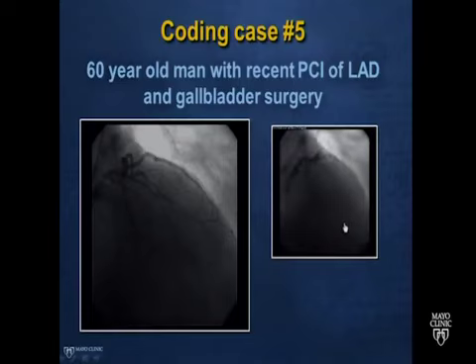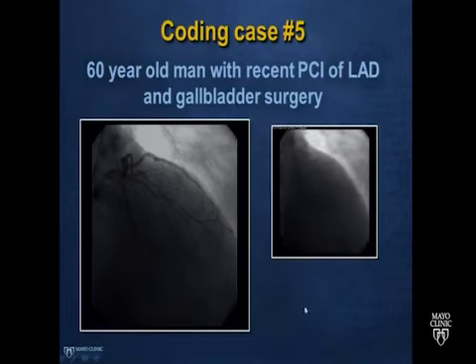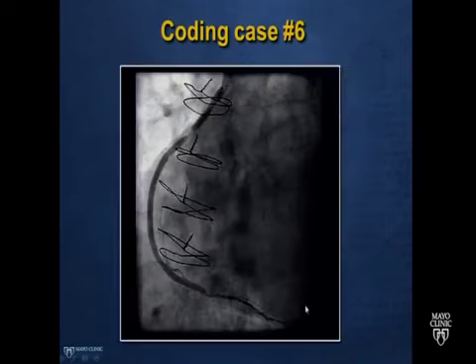And I know this is the LAD because, again, this is the anterior wall, this is the apex, and that movement of the LAD beating down with each heartbeat. Use that to your advantage again. How about this case here?